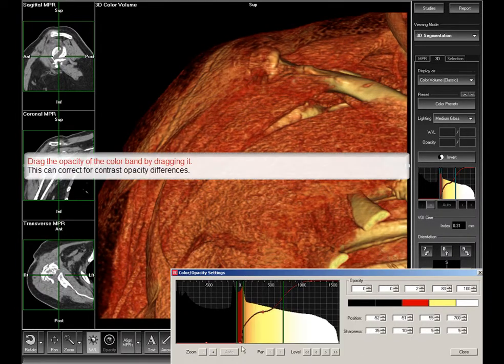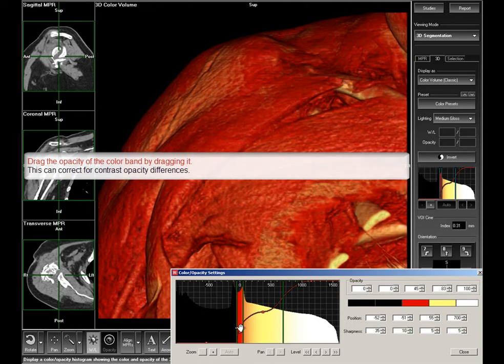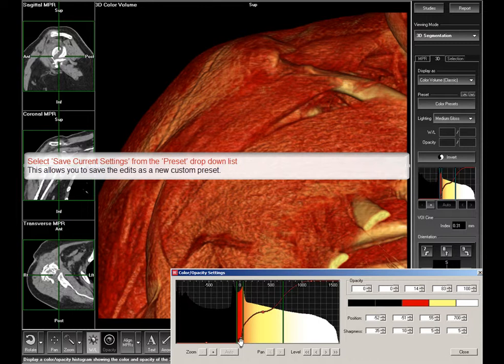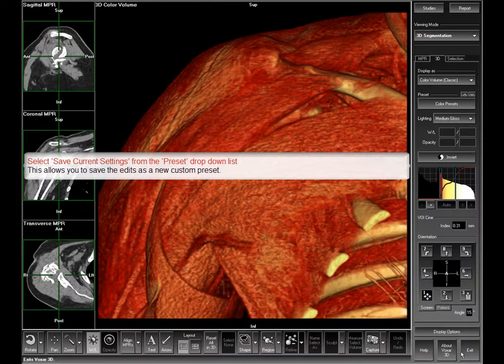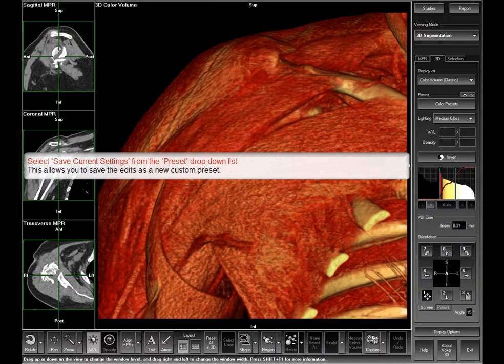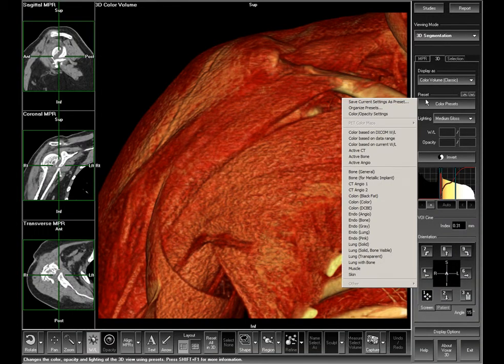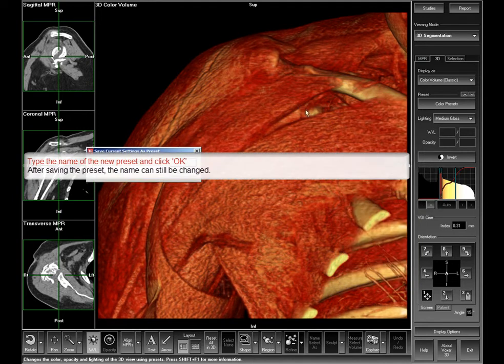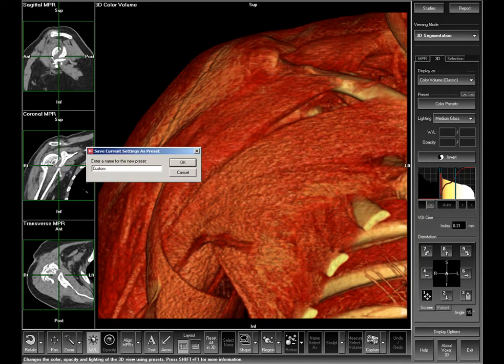You can change the opacity of the color band just selected by dragging the opacity curve up or down. When you are satisfied with the image, select Save current settings as preset from the preset drop-down list. Type the name of the new preset and click OK.